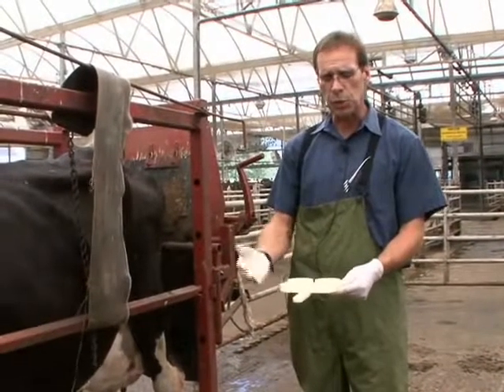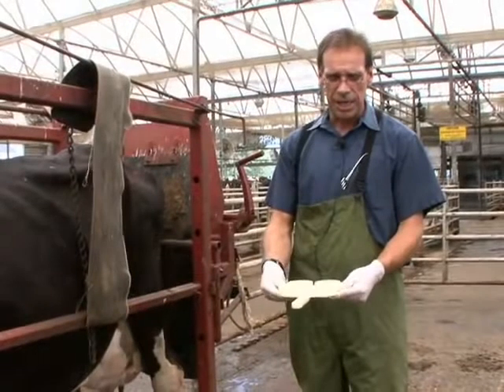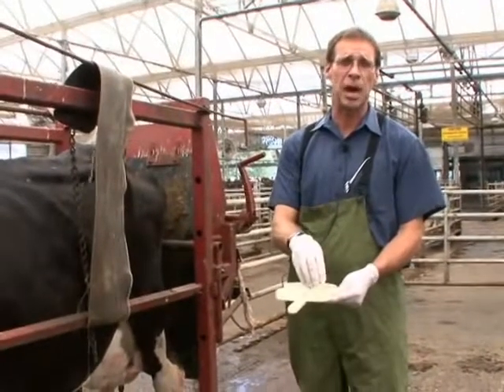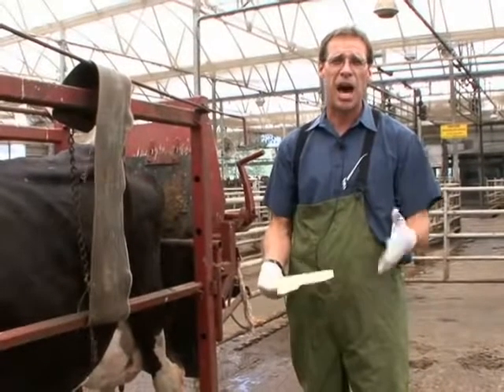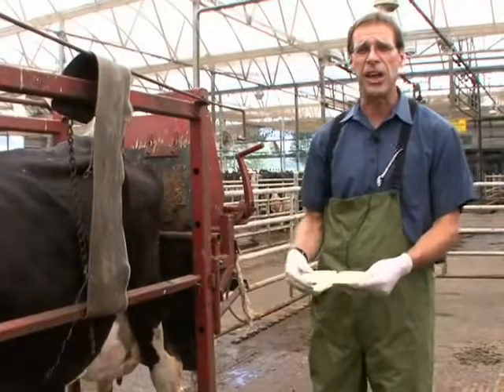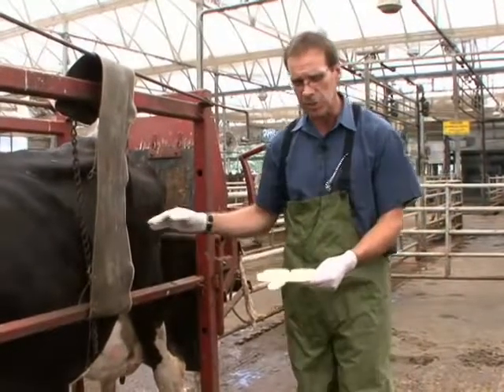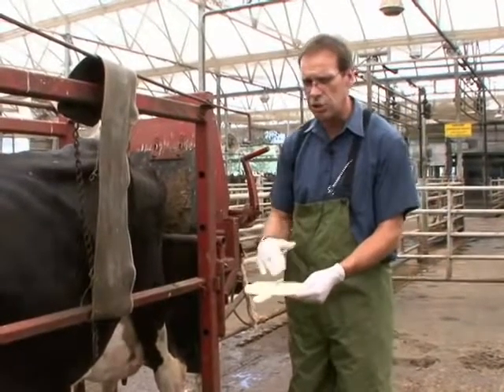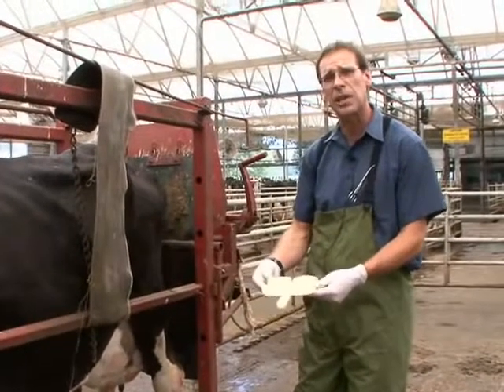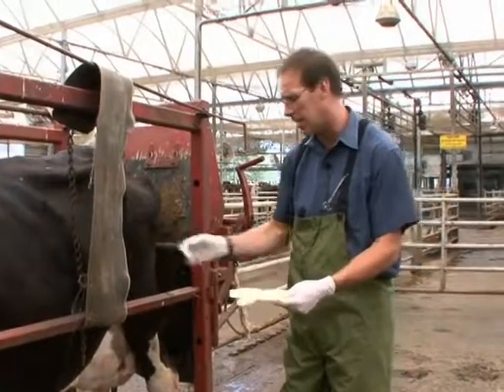So when we read this examination, the stickier, tackier, or thicker the solution becomes, the more likely we have high somatic cell counts, indicating that animal may have infection in that gland. I will demonstrate taking milk, putting it in each of these wells, and then adding the reagent and testing this particular cow with the California mastitis test.